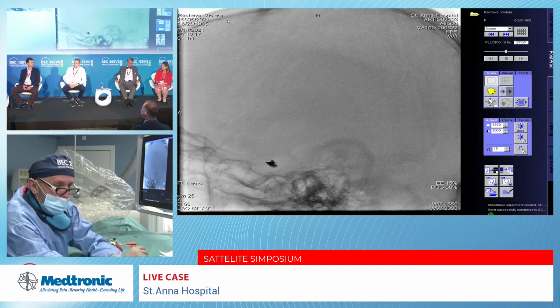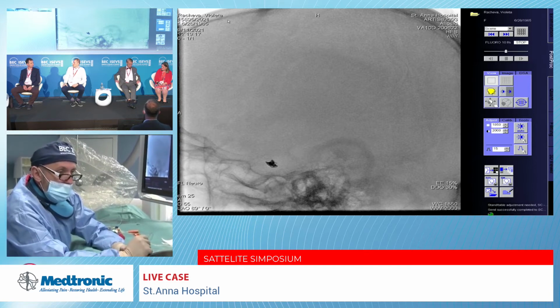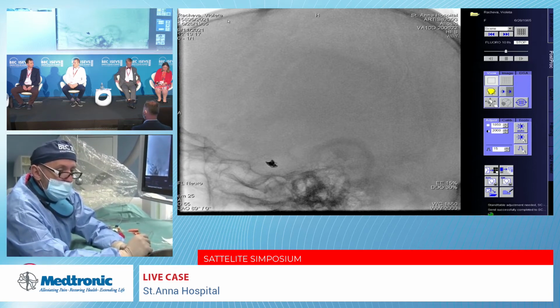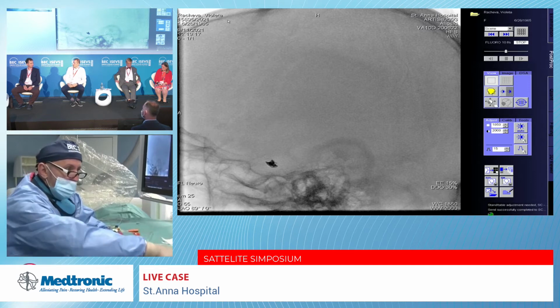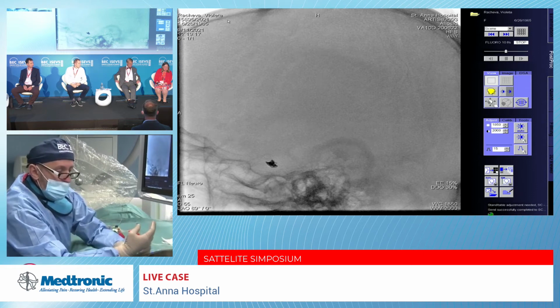I have one significant hyperplasia, and we just consulted. Should I do something? Should I put in a balloon, a dilating balloon or something? They told me, don't touch it. And in 1 year, it was completely resolved. This is interesting. Just aspirin, no sticking to dual antiplatelet. In their experience, they saw a lot of these cases. I'm not sure if they published it with long follow-ups, but on a single therapy in 1 year, it just disappeared. Great.